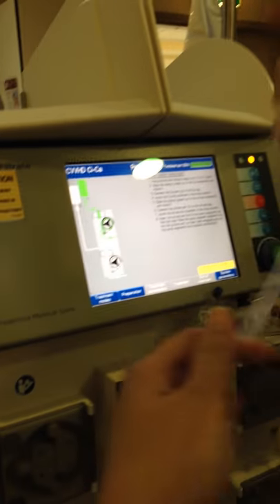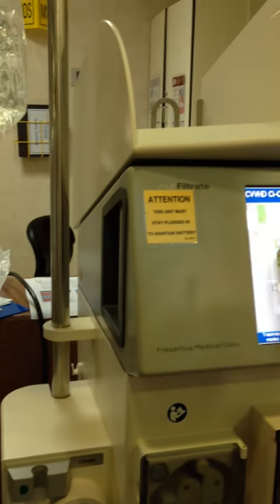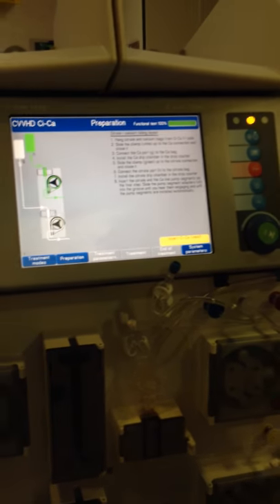All right, now what is next? Connect the calcium port to the calcium bag. Okay, calcium to calcium. So white is the white port. Yes. Calcium. Only connect. Connect the calcium. No shortcut. The shortcut in here is going to be a problem. And then if you have a problem, you do not know how to solve it. This is the calcium, the G.